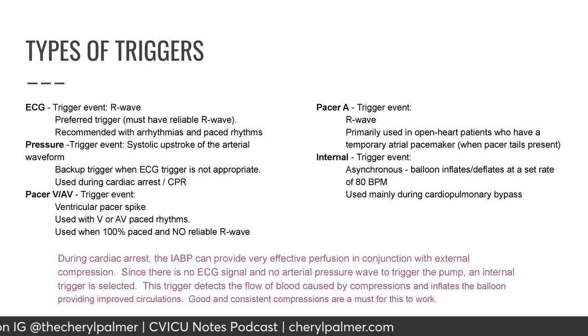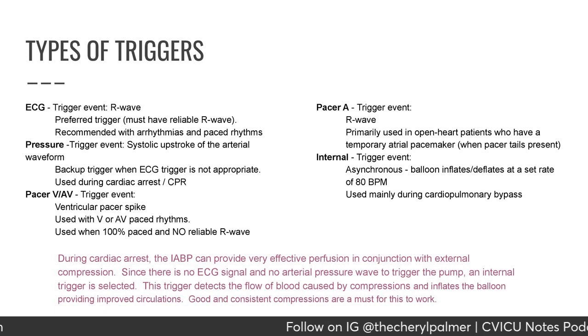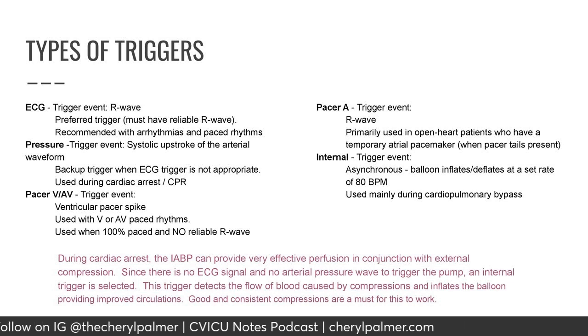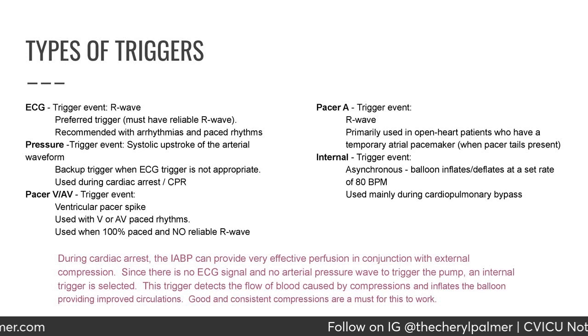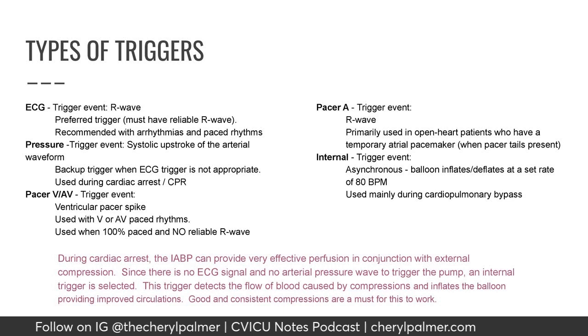And then you have a pacer A trigger event, which is the R wave, primarily used in open heart patients who have had temporary atrial pacemakers when the pacemaker tails are present. Internal trigger event. This is an asynchronous balloon. Balloon inflates and deflates at a set rate of 80 beats per minute, for example. Used mainly during cardiopulmonary bypass.